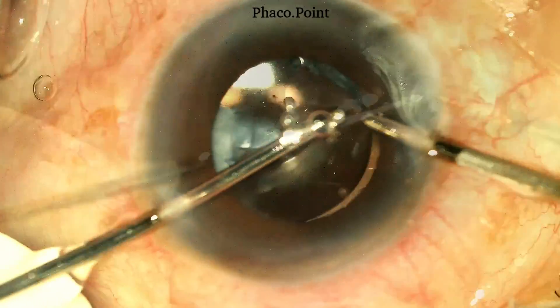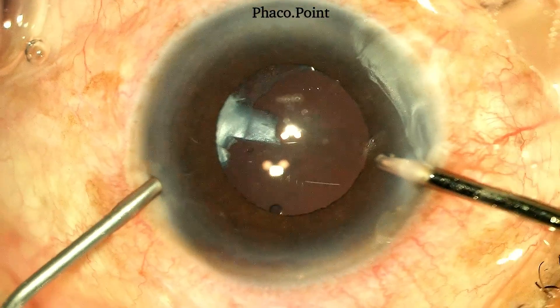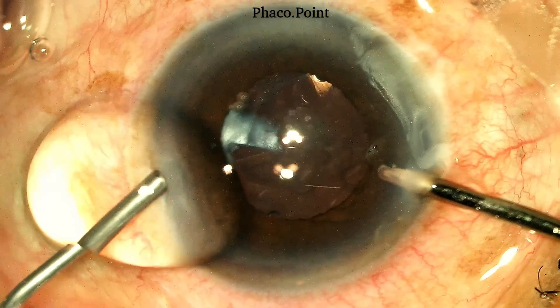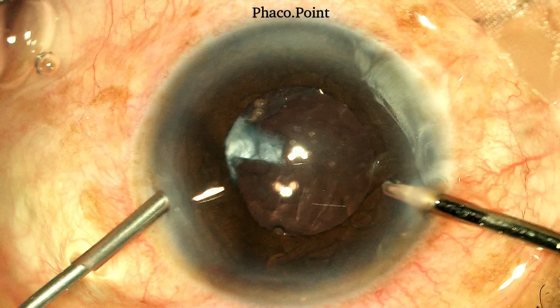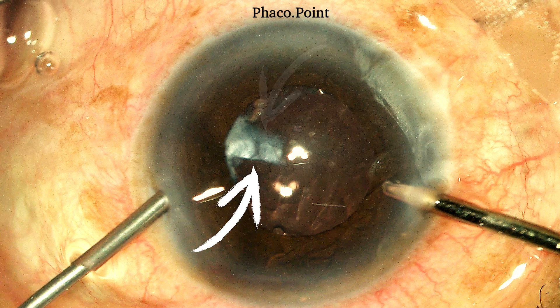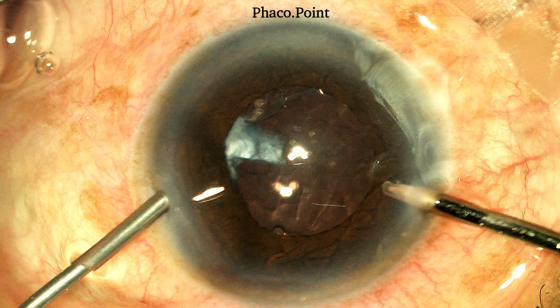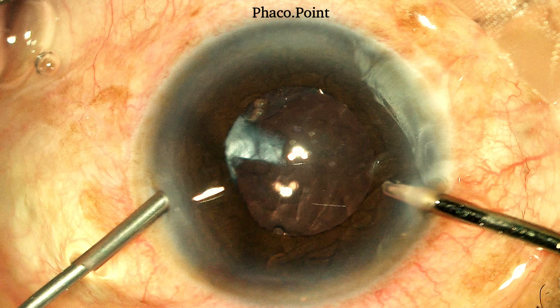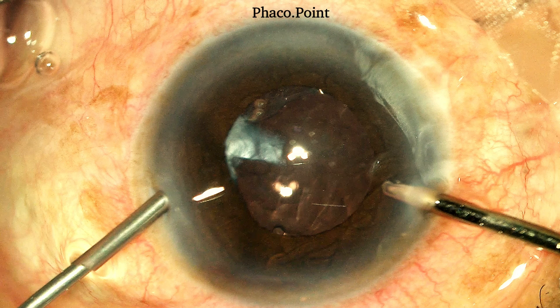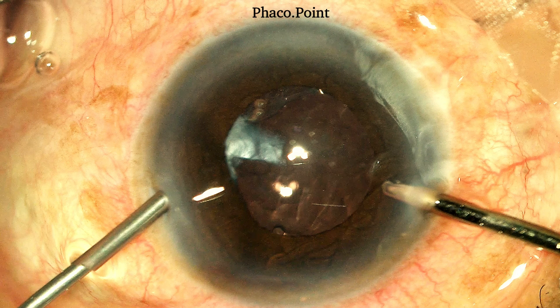On completion of the cortex removal, the aspiration cannula is removed and a visco-fluid exchange is performed. It is important to remember that there is an existing nasal PCR, so it is very important to perform a visco-fluid exchange each time the irrigation comes out of the eye, so as to prevent any sudden shallowing of the anterior chamber and a possible enlargement of the PCR.